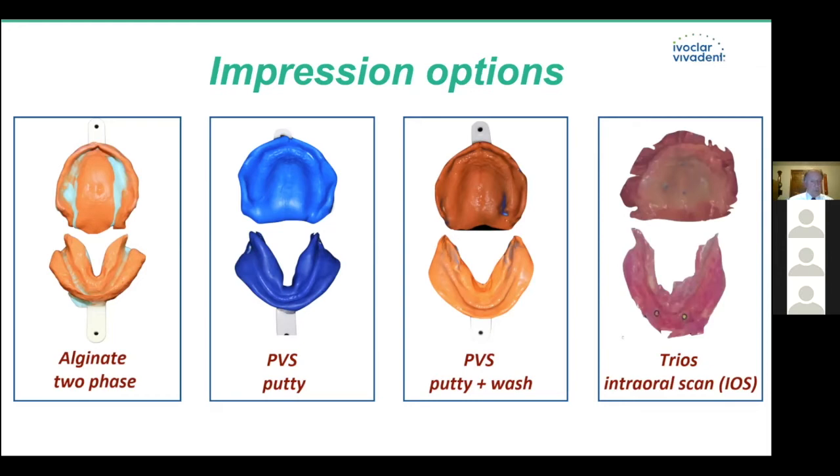Could you do intraoral scanning? Of course you could. And I will dare say in, I don't know, a couple of years, maybe longer, maybe shorter, I think this will be what you will be doing as a routine. Intraoral scanning is becoming more popular. I must admit I don't have a lot of experience, so I can't give you a lot of personal thoughts here, other than scanning the maxillary arch is a whole lot easier than scanning the mandibular arch. And in my hands, I could probably do pretty good routinely getting a good maxillary extended intraoral scan.